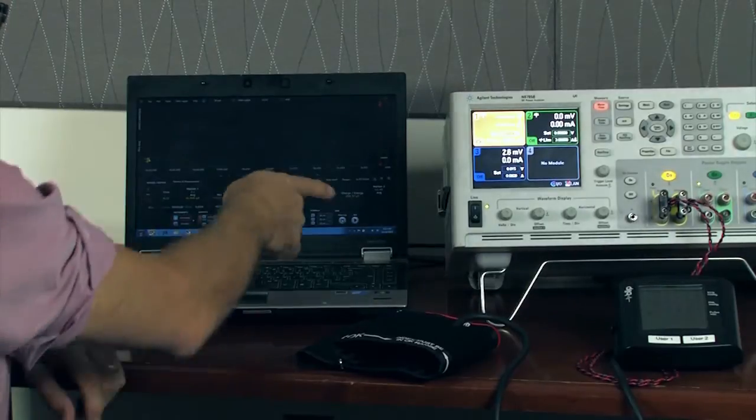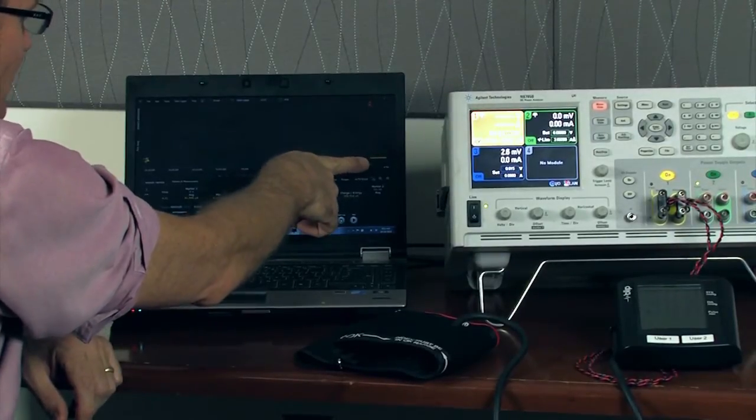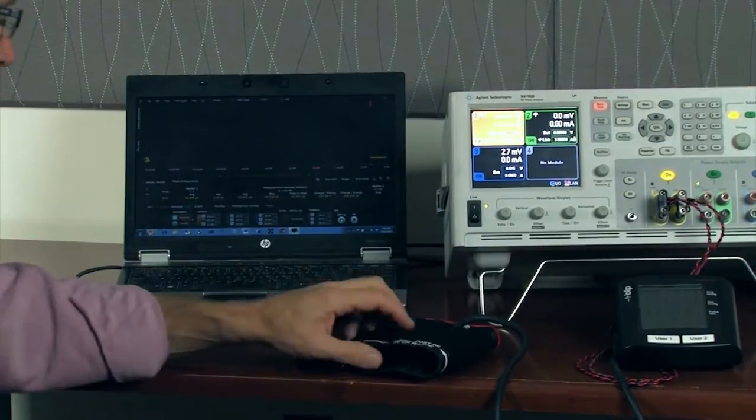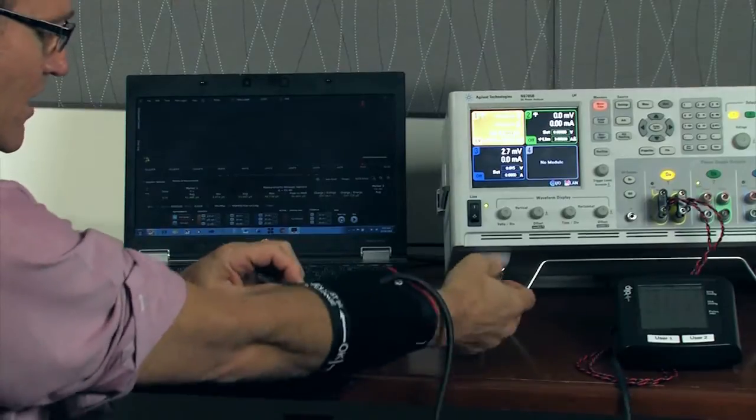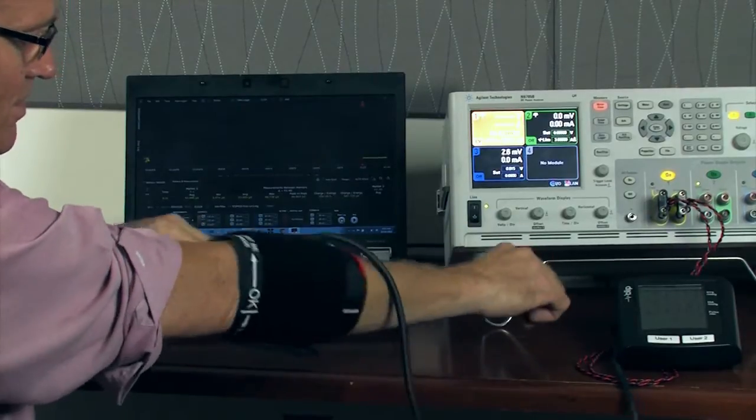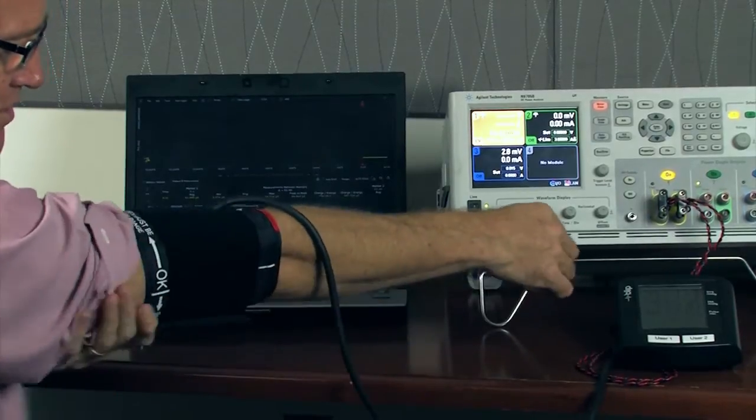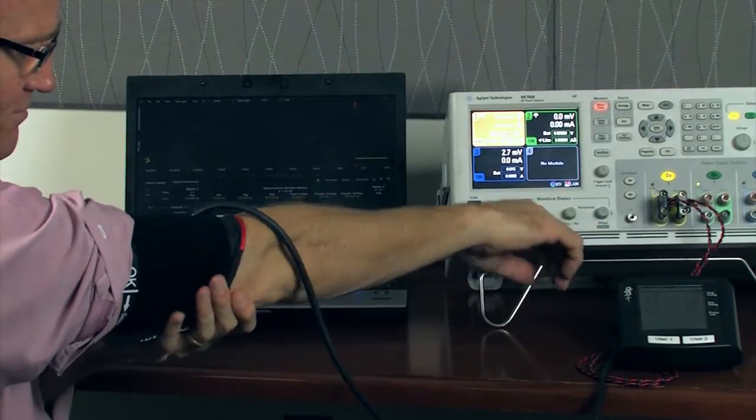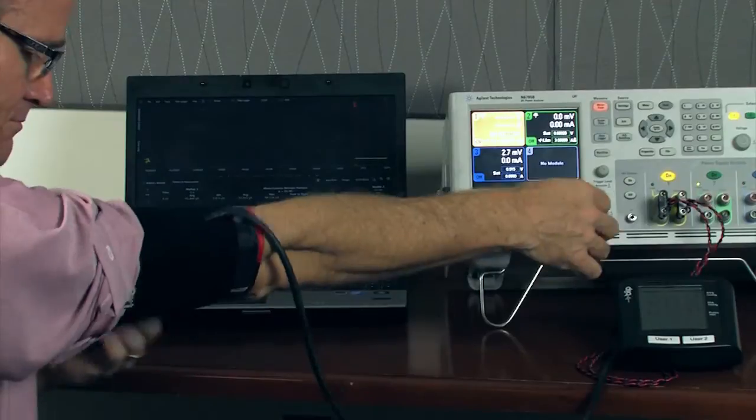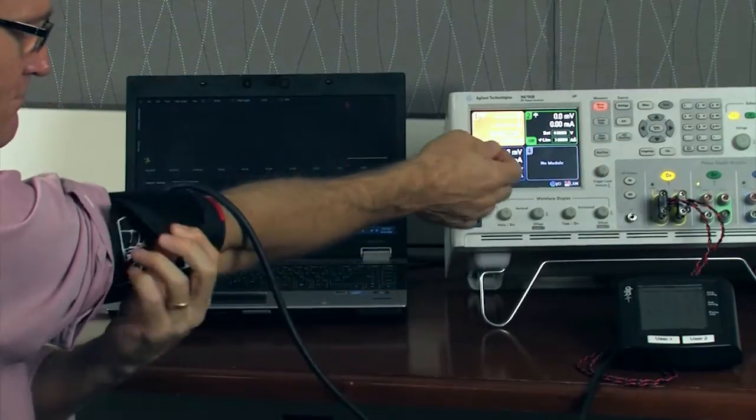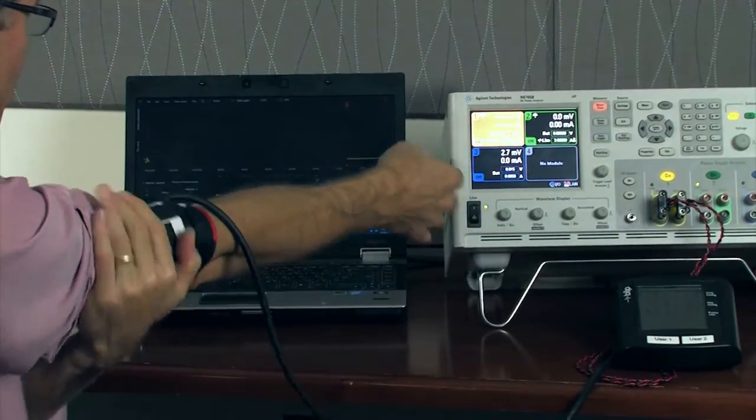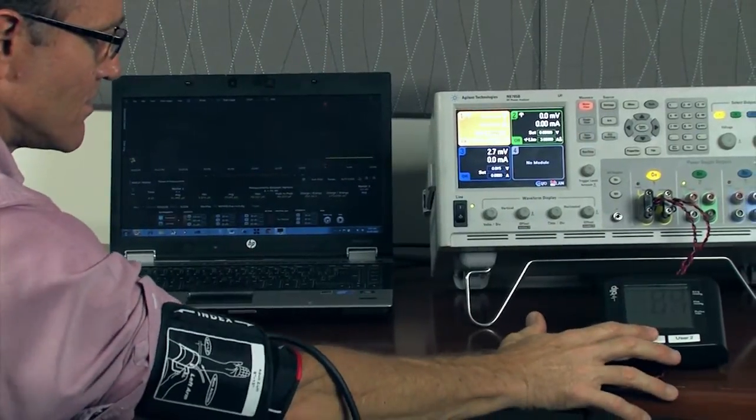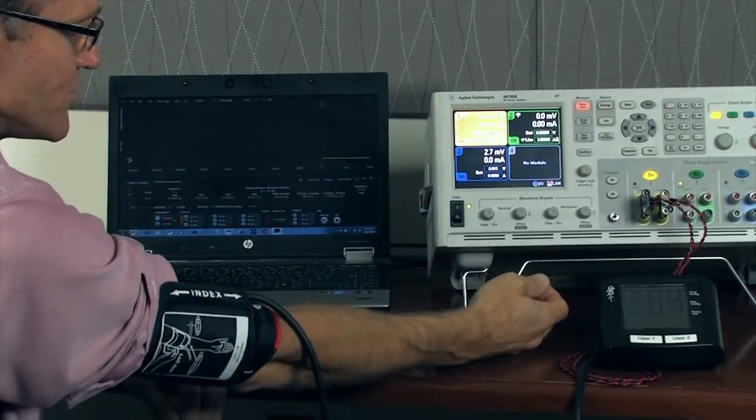So here you can see the basic data logging has started. I'll go ahead and put on the blood pressure cuff. And I'll take my blood pressure.